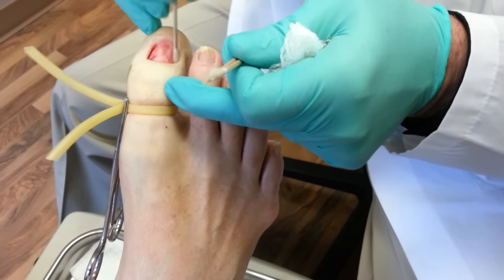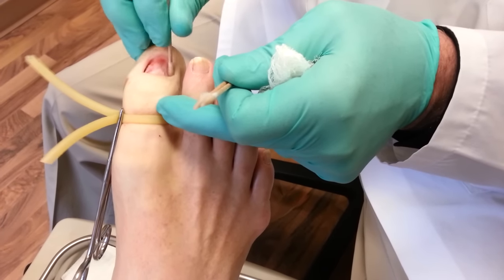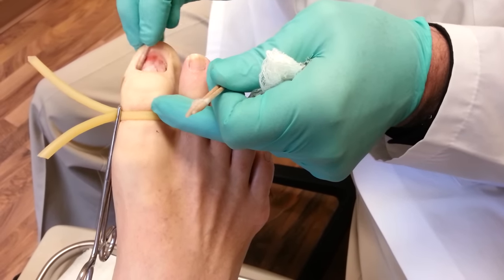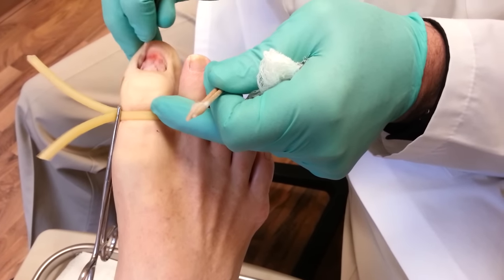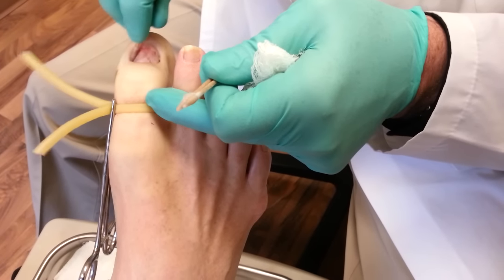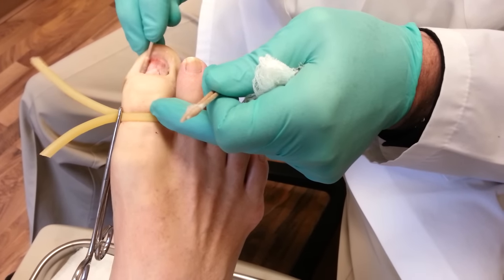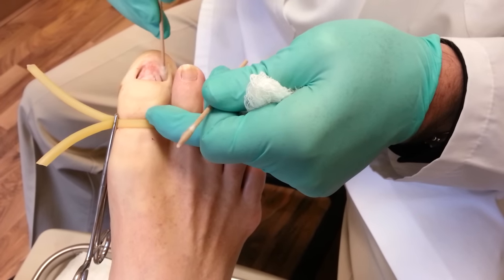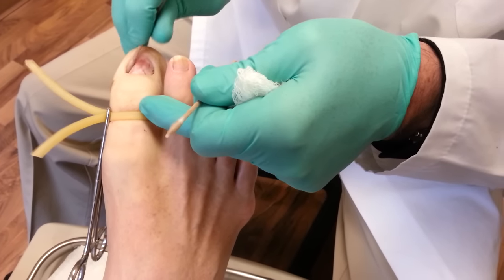Now what we do is put phenol on the root, and that kills the cells that make the nail grow. We generally do this for three separate times, looking at the nail for about 20 to 30 seconds each time.